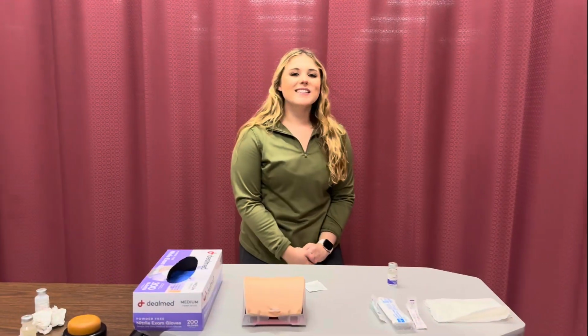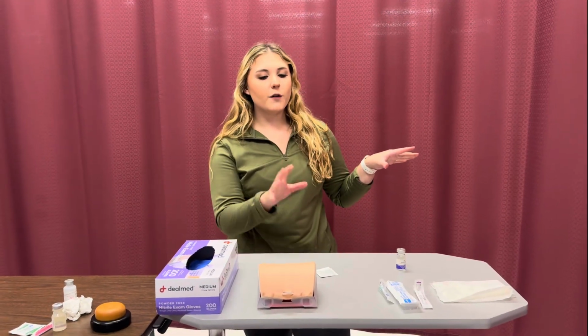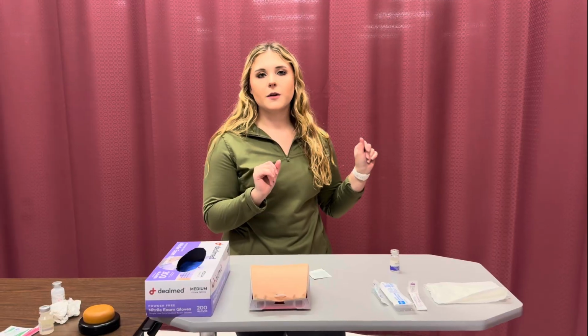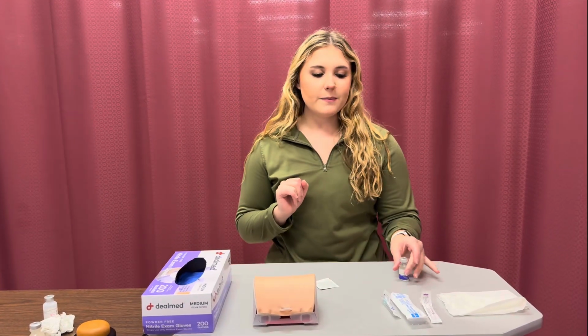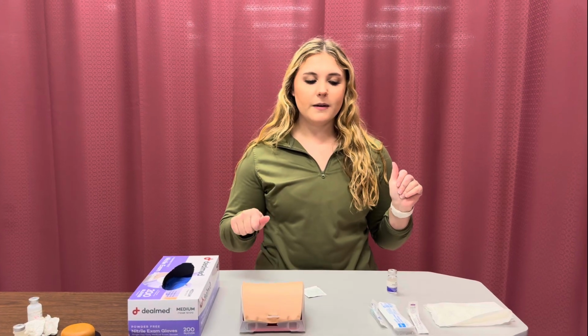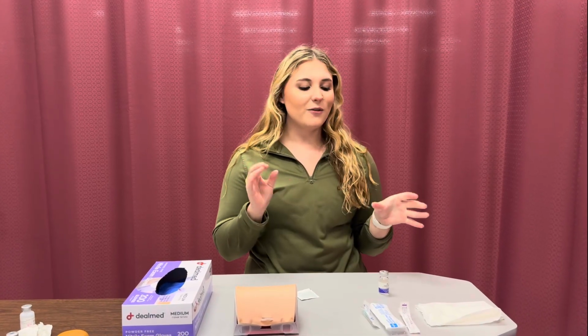Hi, my name is McKensi and I'll be performing an intramuscular injection today. Before entering the room, I would check my doctor's order and confirm that this patient is receiving a 1 milliliter dose of sodium chloride. So after entering the room, I would introduce myself to the patient. I would verify the patient's name and date of birth, and then verify my 9 rights.